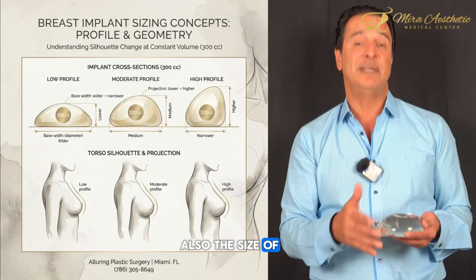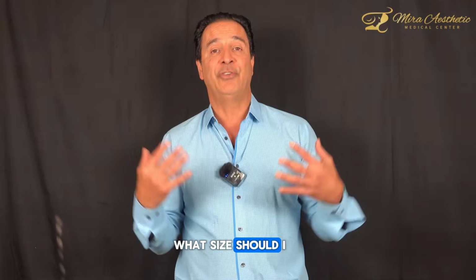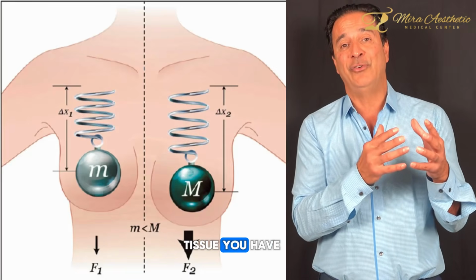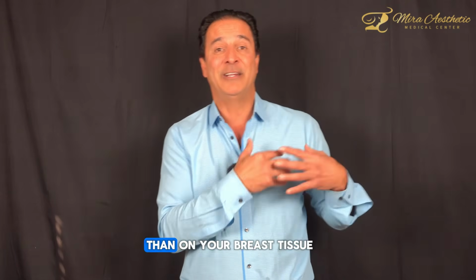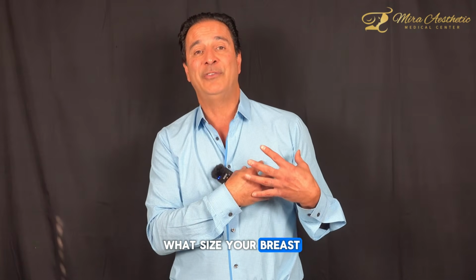Also, the size of the implant is really important. A lot of people say, hey, what size should I go? That rule also applies to how much breast tissue you have. If you want to be more fake looking, you basically put in more implant than your breast tissue. So you guesstimate what size your breast tissue is.